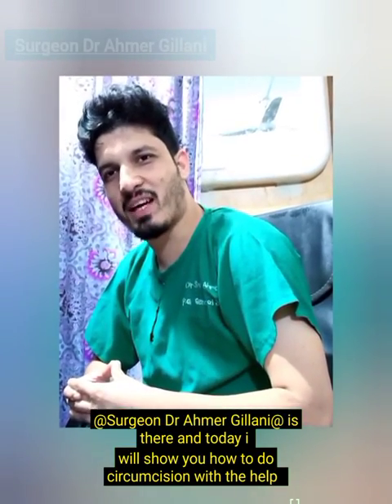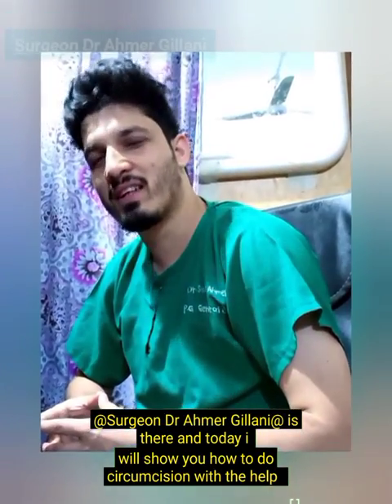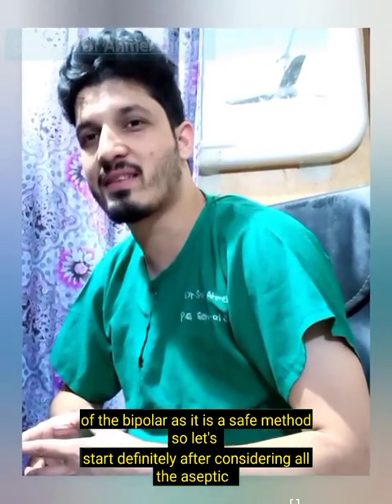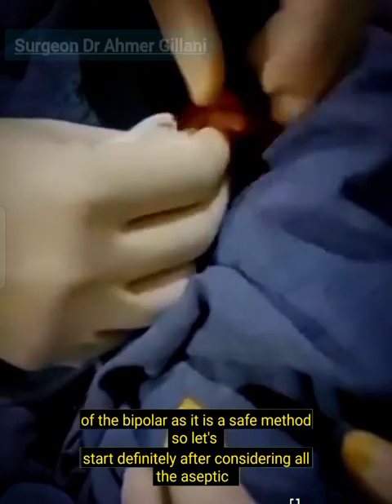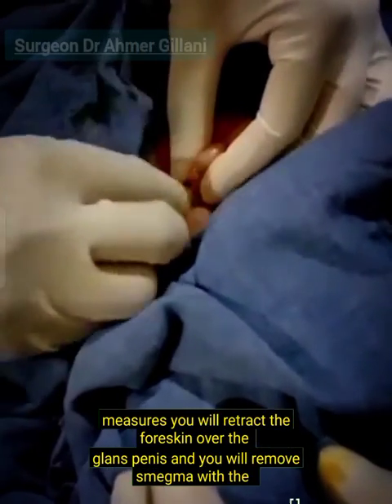I am Dr. Emir Ghani, and today I will show you how to do circumcision with the help of the bipolar cautery, as it is a safe method. So let's start, after considering all the aseptic measures.